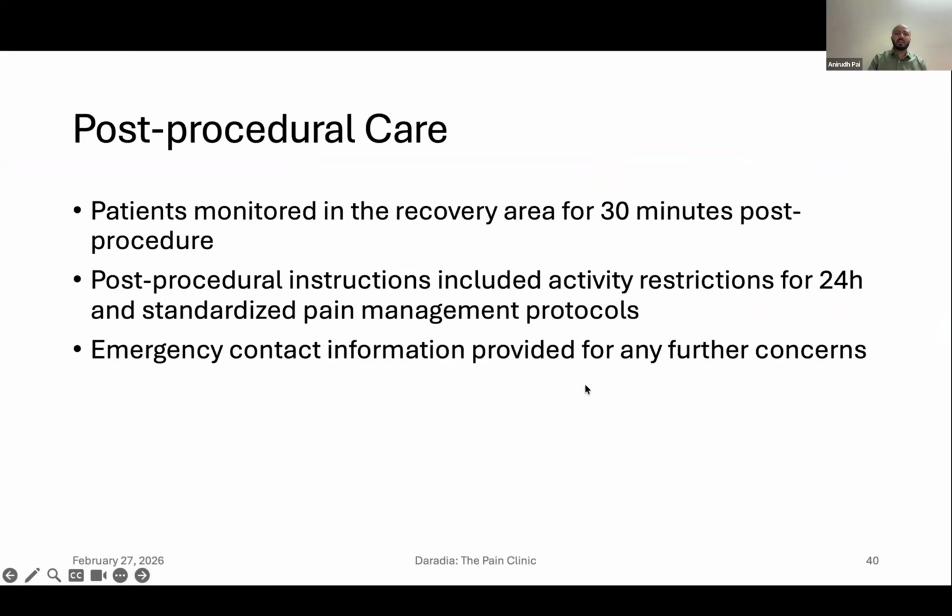Post-procedure care: all the patients were monitored in the recovery area for 30 minutes, and they were advised activity restriction for 24 hours, and they were asked to contact us if there was any concern.